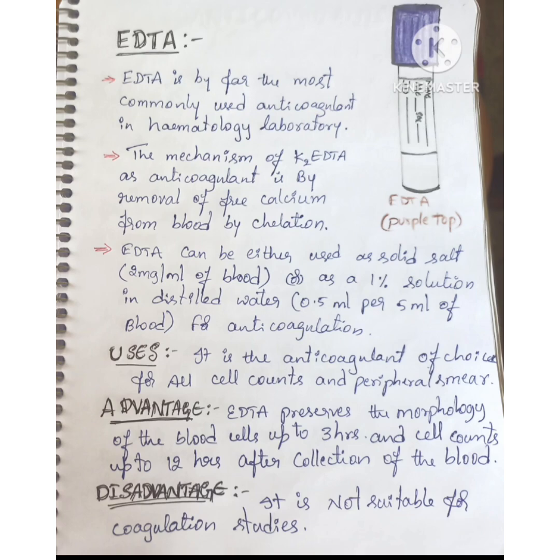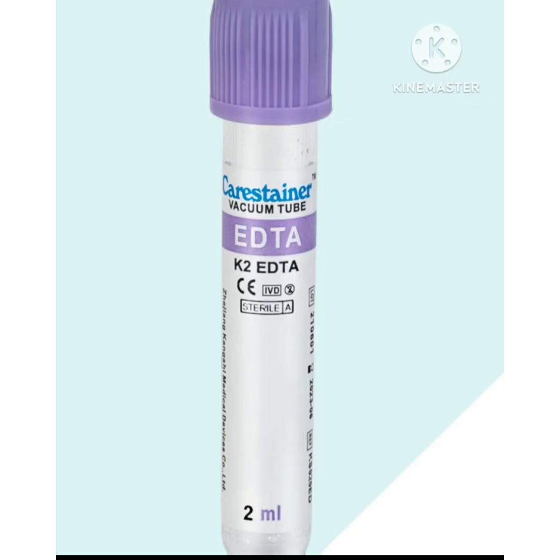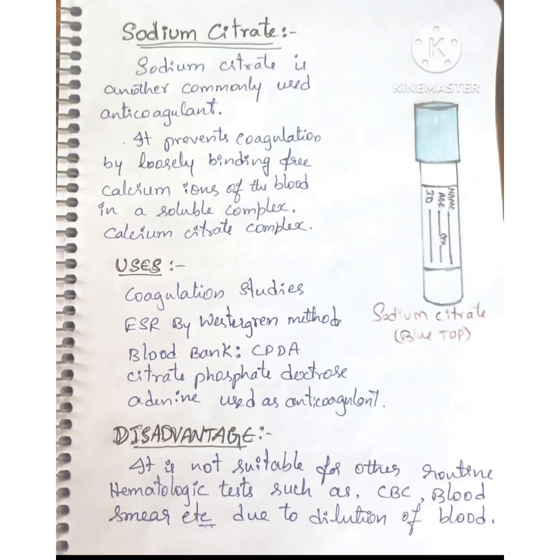The advantages of EDTA anticoagulant are: EDTA preserves the morphology of the blood cells up to 3 hours and cell counts up to 12 hours after collection of the blood. The disadvantage is it is not suitable for coagulation studies. The color code of EDTA vacutainers is purple or lavender. Next, we are going to learn about sodium citrate.